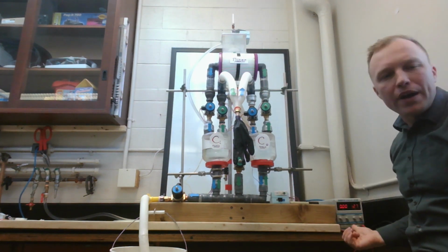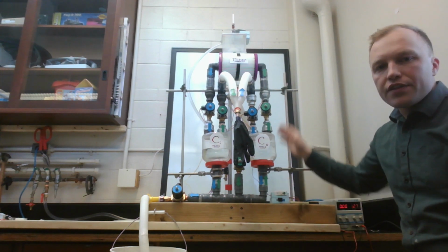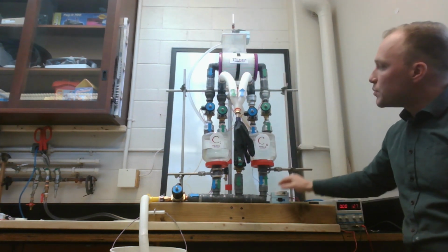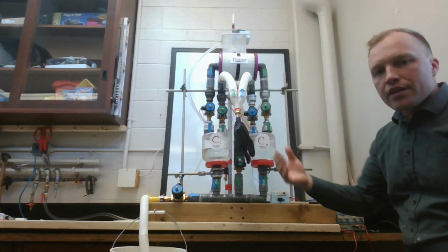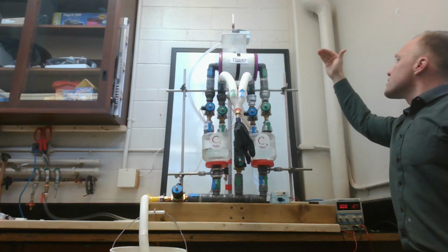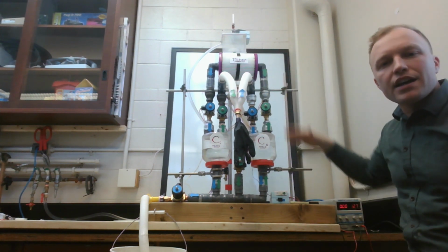We've got our 12-volt power supply here. We've got a couple of switches that are controlling the series of valves. The green switch on the top is going to be controlling the in-breath, so the glove will inflate. The blue switch, the exhale. Our cistern is filled with water and has a switch on it to keep it filling as water gets drained out of the system.